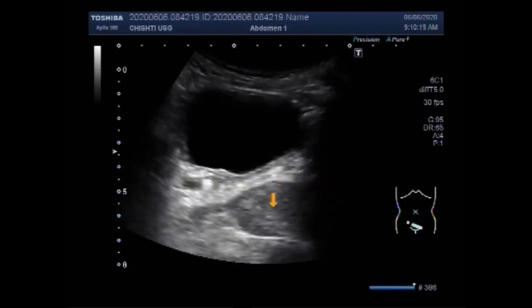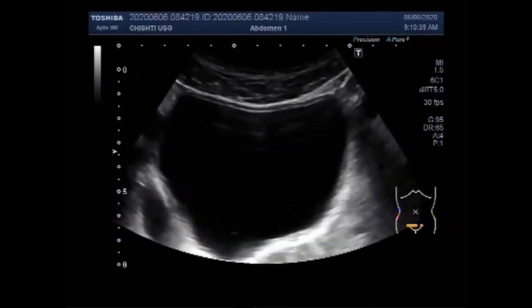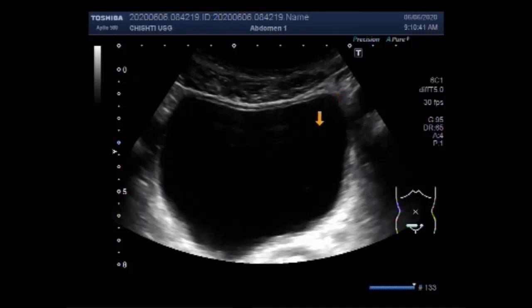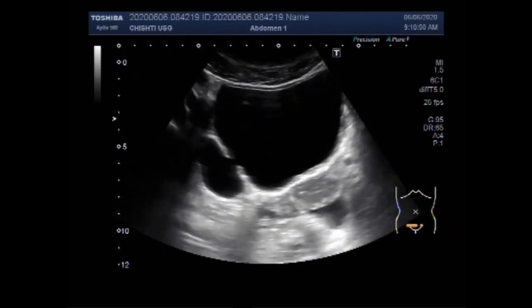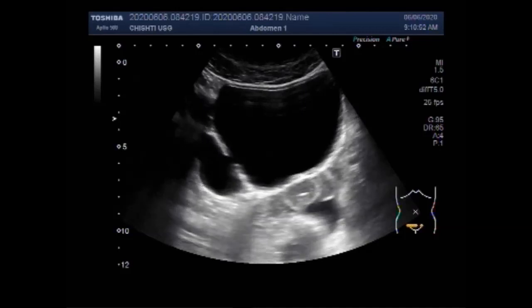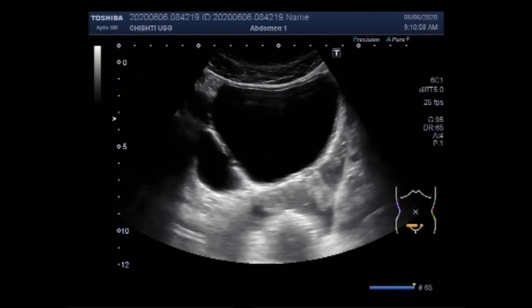Now you will see this is the prostate, and now you are going to see the diverticulum of the urinary bladder. A bladder diverticulum is a pouch in the bladder wall that a person may either be born with, that is congenital, or get later, acquired. A congenital bladder diverticulum forms when some of the bladder lining pokes through a weak part in the bladder wall. With acquired diverticulum, many pouches often form.